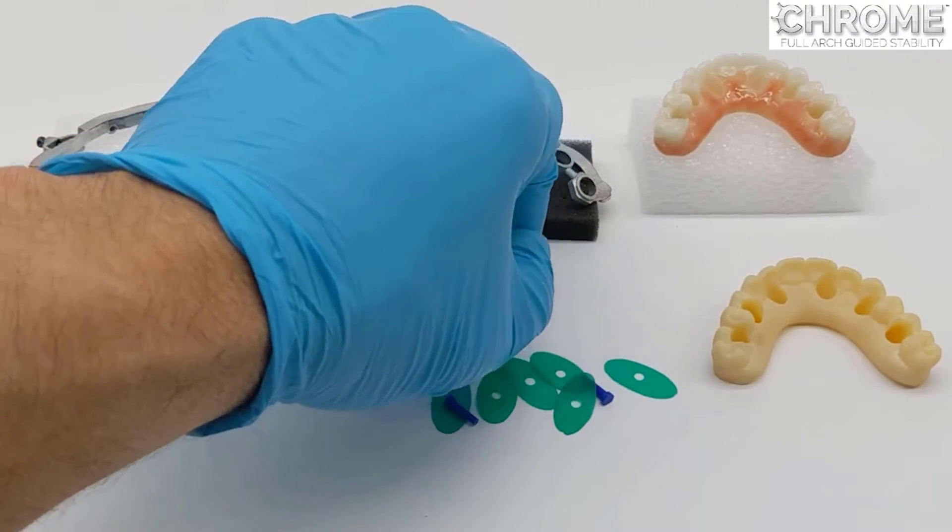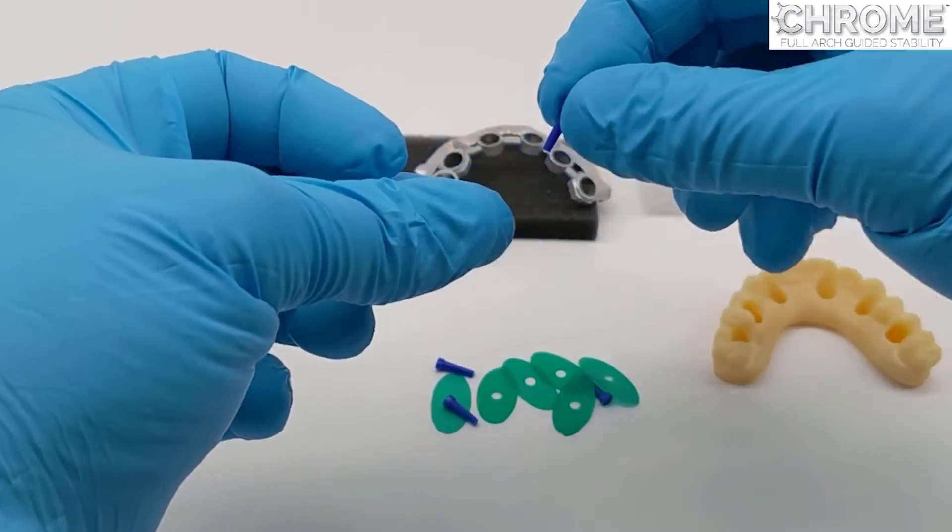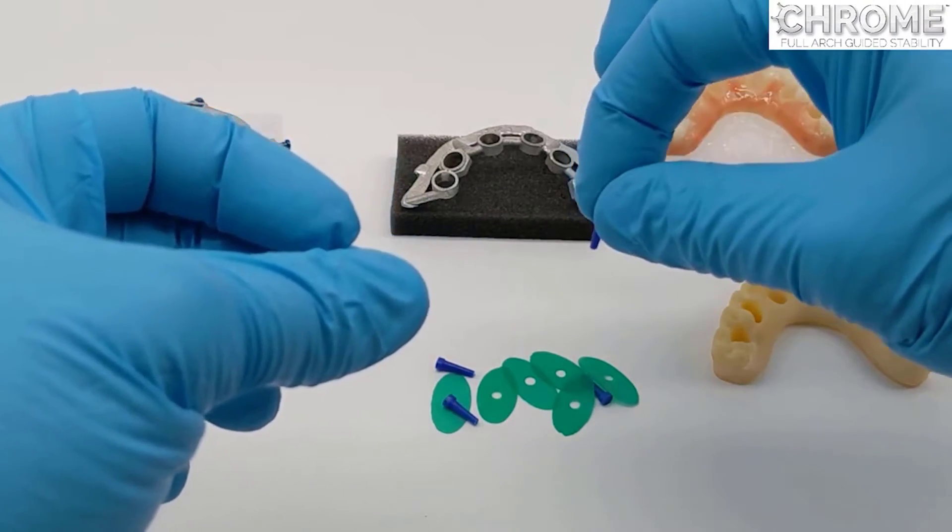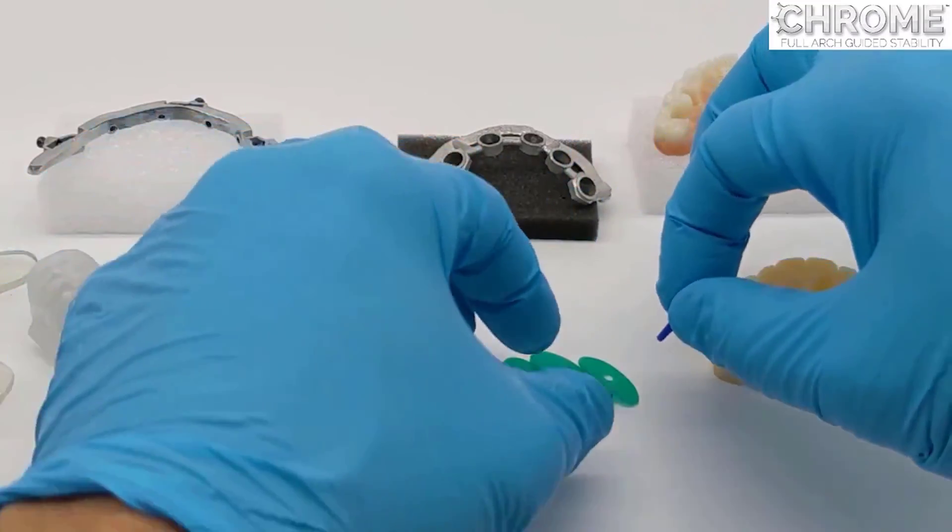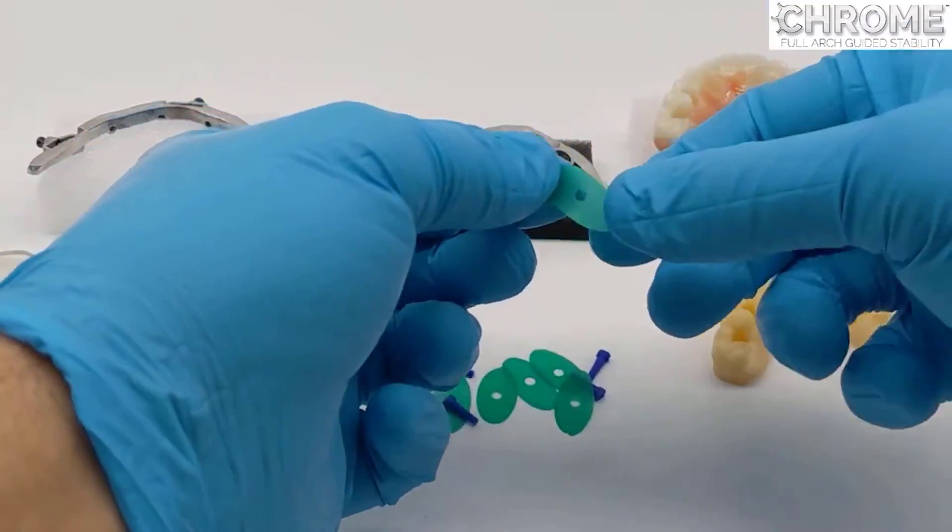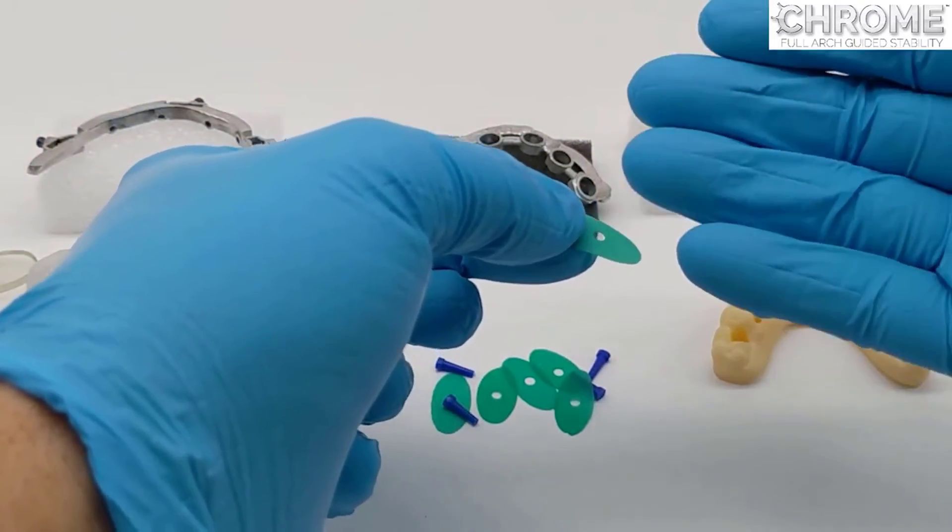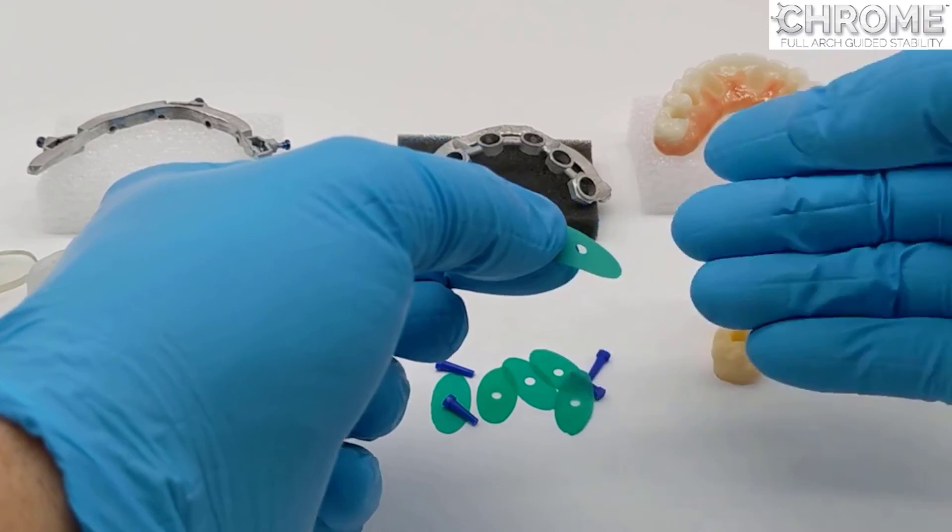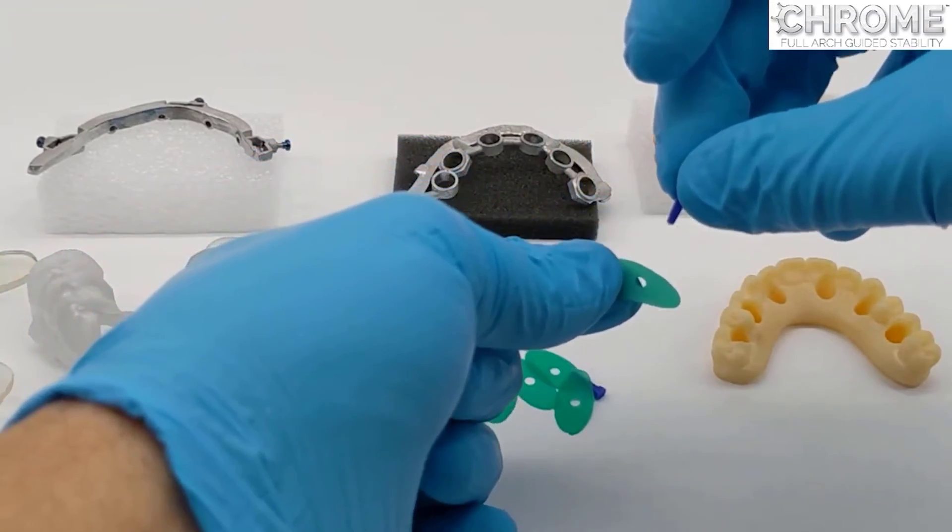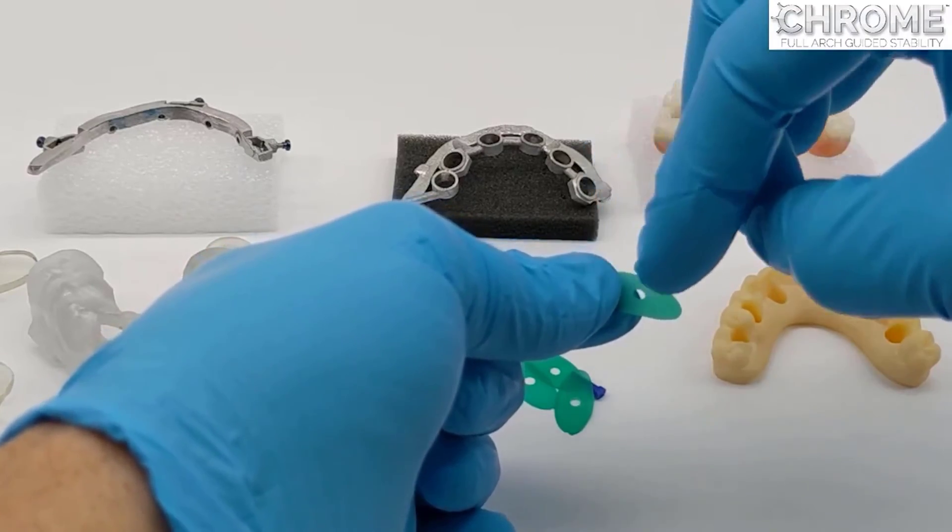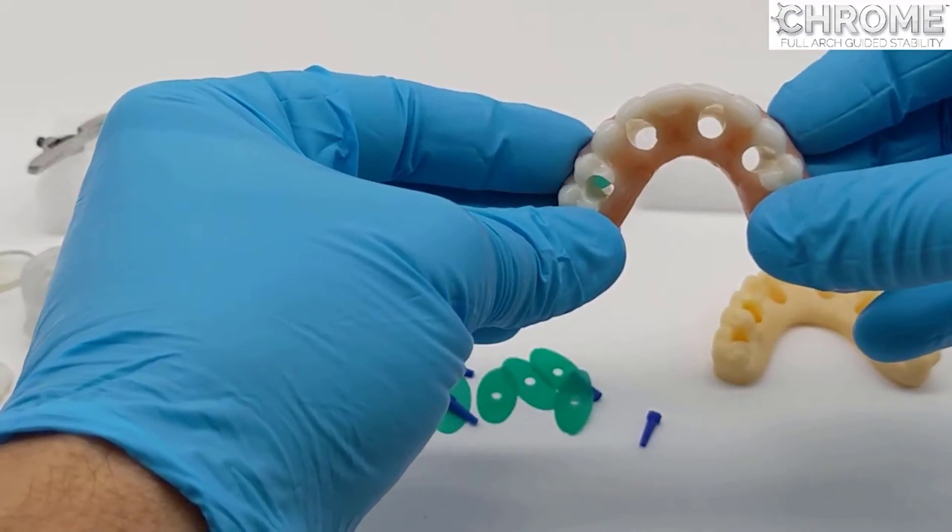Each case will come with six blue plugs and six green gaskets. The plugs are used to plug into the temporary cylinder to block it out so you don't get material down inside the temporary. The green gaskets will sleeve over the temporary cylinder to protect the mucosa and anything below the carrier guide. So it's double protection: a sleeve for underneath and a plug for the top when you backfill the hole around the temporary cylinder.